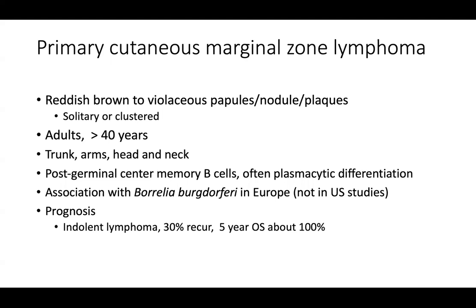That's important because if you have enough plasma cells within the neoplasm, you can begin to think about a workup that you can stain for either kappa or lambda light chains. And so that becomes very important in demonstrating monotypic expression.